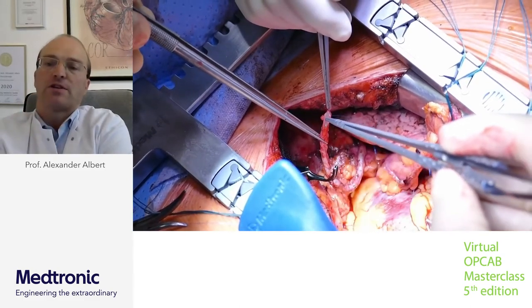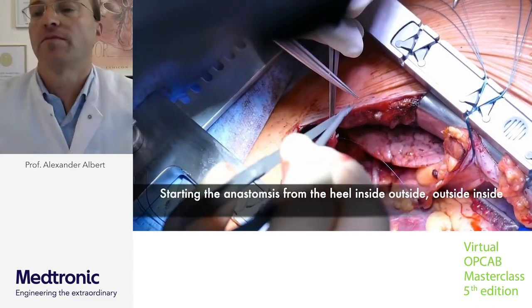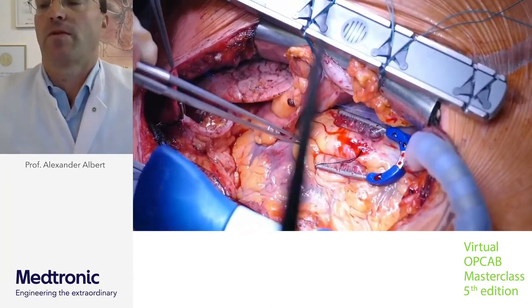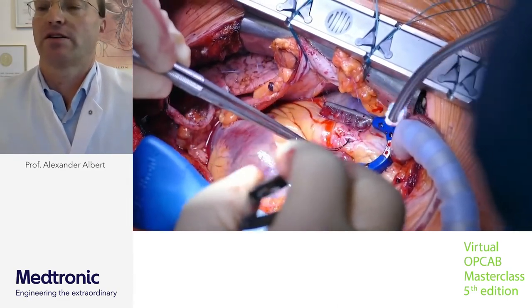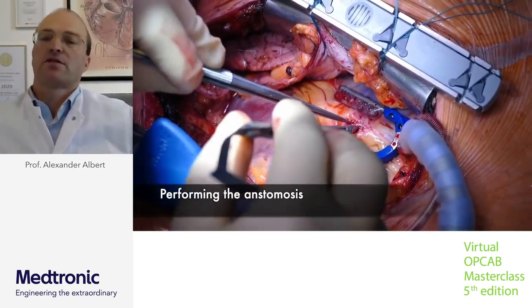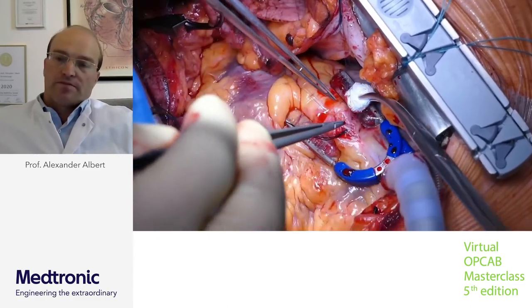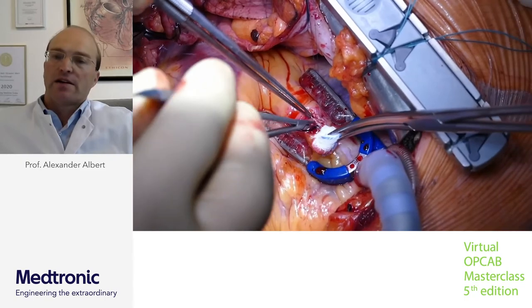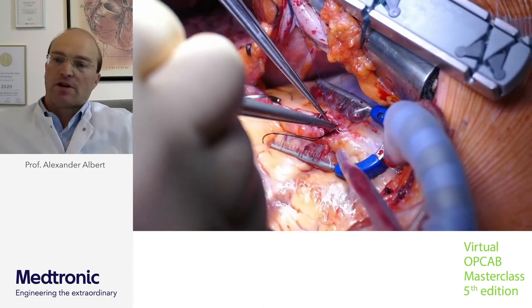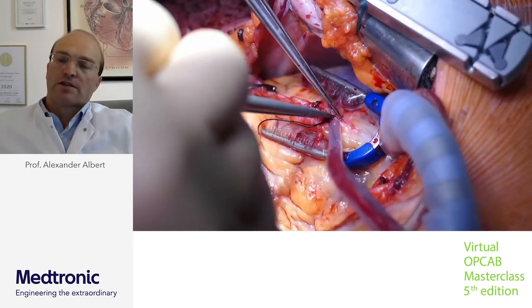For the anastomosis, as we teach in Professor Santich's anastomotic skill course, we start from the heel — bringing down these two stitches inside-outside, outside-inside — then bring down the mammary artery and suture left-sided around the coronary. Of course, there are many ways to perform a good anastomosis. You see the heart is contracting very well and is calm. The surface is viable with good color.